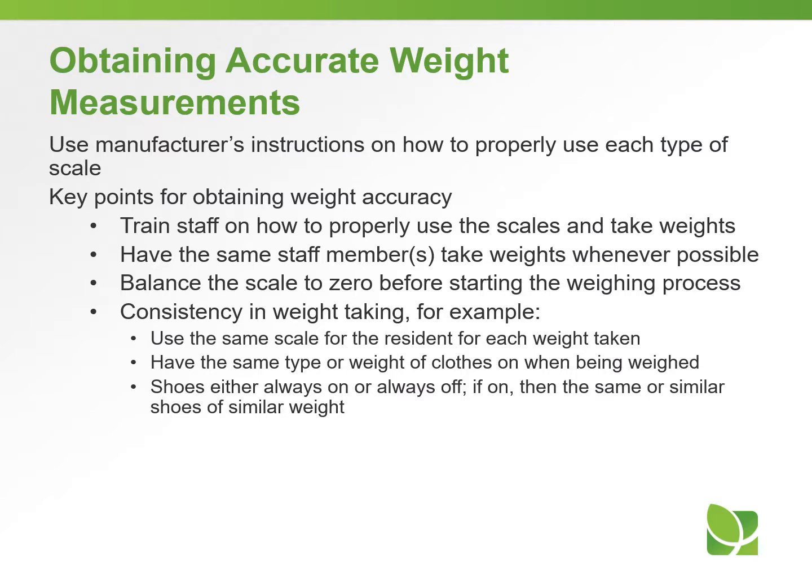Consistency in weight taking. For example, use the same scale for the resident for each weight taken. Have the same type or weight of clothes on when being weighed. Shoes either always on or always off. If on, then the same or similar shoes of similar weight.